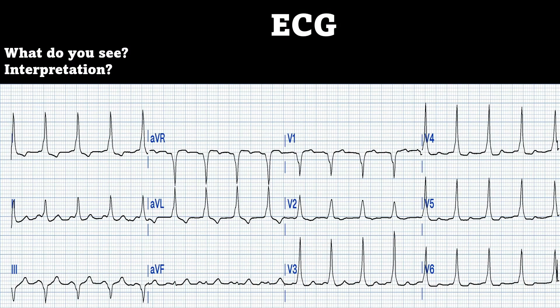Here's his EKG — what do you see? Pause the video and see if you can determine your own interpretation of the rhythm. What I see is a rate around 105 beats per minute. I'm a lazy person with regular rhythms — I always try to use the big box method to determine the rate. I have some arrows pointing to some weird morphologies in V1, AVL, and V5. You can also see them throughout in lead two, V4, and V6. There's a little blip at the very beginning of each QRS complex. There is a short PR interval and up-slurring of your QRS complex. This makes me think the patient has Wolf-Parkinson-White syndrome, which is the pre-excitation syndrome.